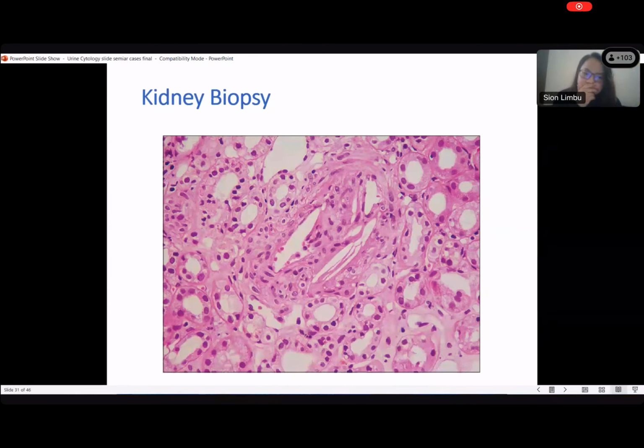And when you have these needle-shaped structures, what do they usually represent? It can be anywhere else in the body. So what do you think these may represent? Cholesterol. Very good, absolutely. So this is a thrombus, which you correctly identified, if you can call it that. It's composed of cholesterol crystals.